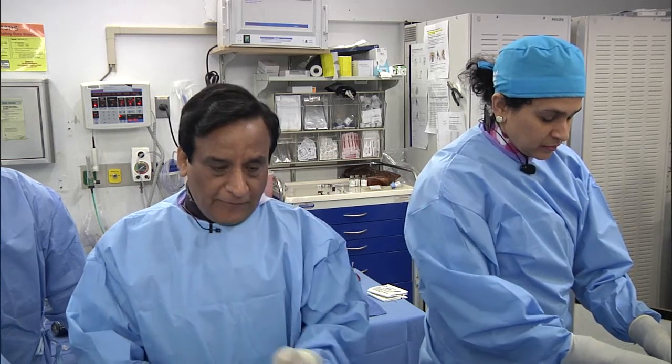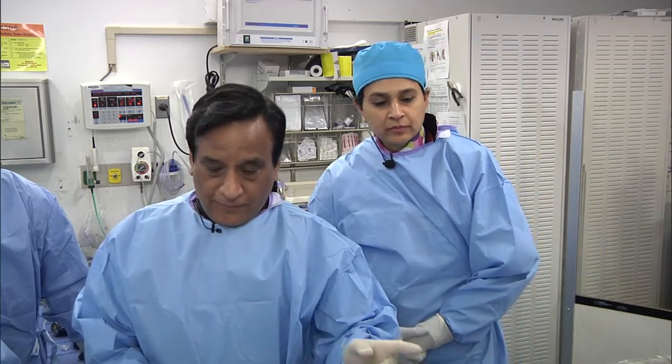I must be honest, when I looked at the angiogram, I said many people will guess whether this is going to have a significant lesion with FFR. And that is precisely what people want to be challenged in their practice. Knowing that FFR has come quite a bit into the whole equation of our decision making and routine practice, whether bifurcation or non-bifurcation. We felt we have this challenging case which is not truly complex, but there are a lot of emerging concepts we are going to share, particularly with imaging, FFR, and OCT. We are sorry for the delay with logistic issues, but we are ready to start.